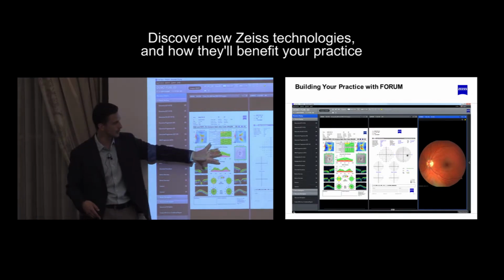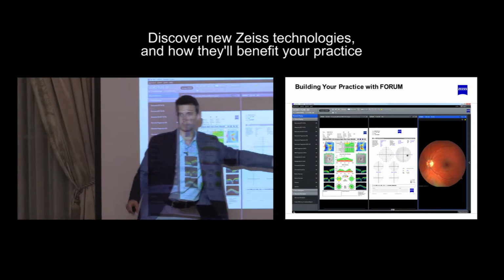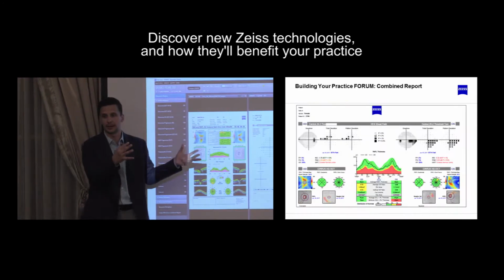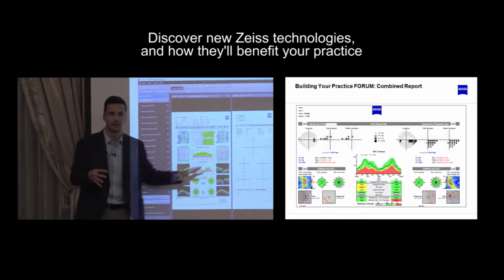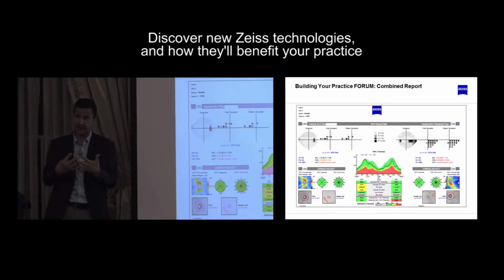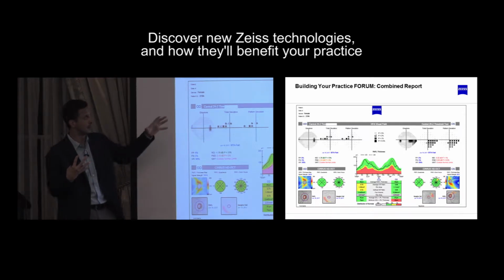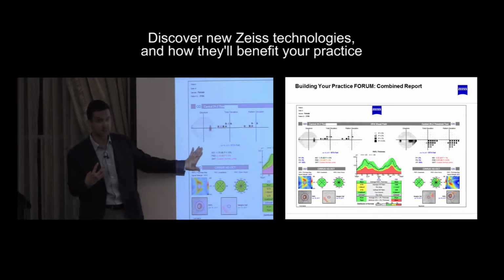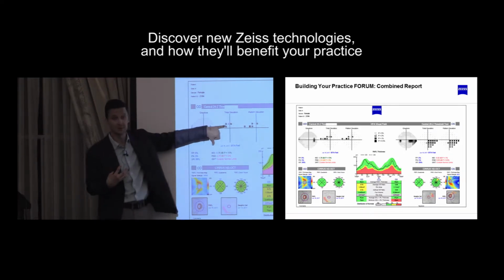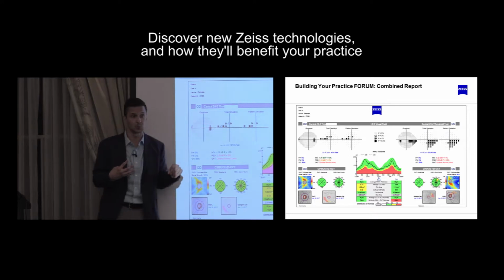You can put into it PDFs or images which are flat. There's nothing in these images that you can do to twist, okay? There's nothing about that, that's a file. But when you take that stuff and you put it into a file that connects, now you get something like a combined report. You could have this with a disk image. I was referencing before a blue filtered disk image coming out of the Clarus that connects directly with what you have happening in your visual field.